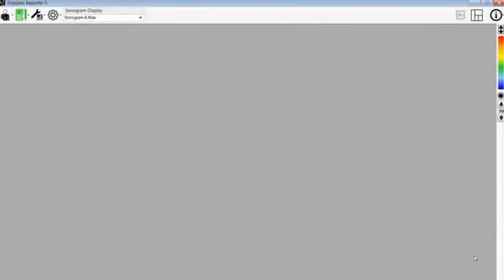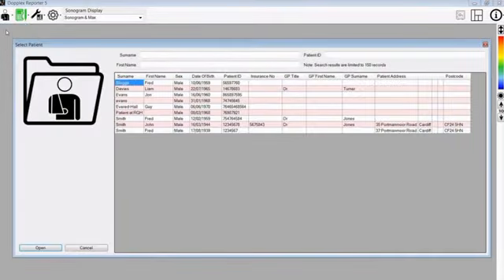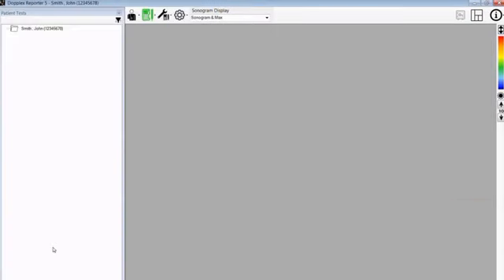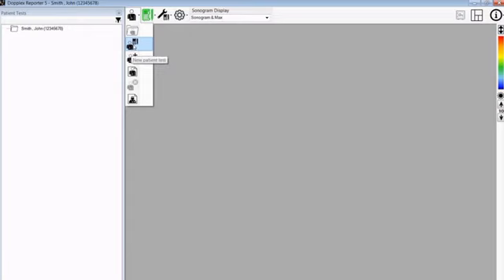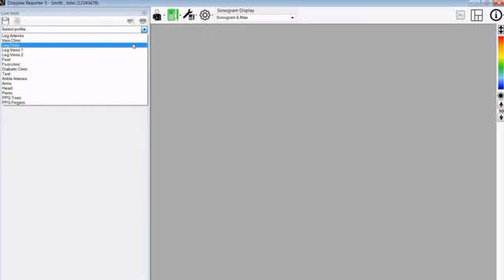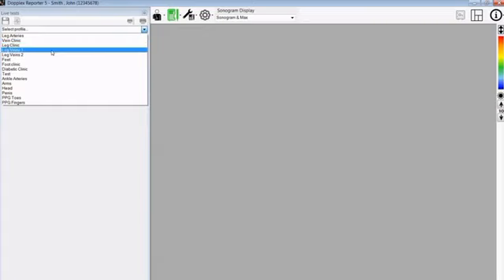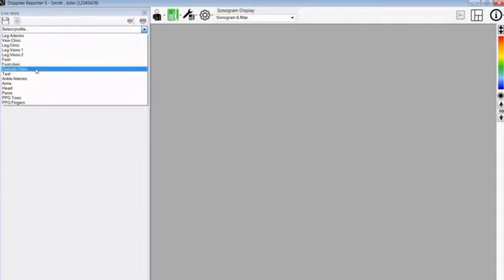We are now going to show you how to record a new patient test. Go to the patient menu and select open patient, and select the patient that we entered the patient's details for before. In this instance, it was John Smith. You can double click or press open and now you can see his details here. You can now go to patient menu and select new patient test — this is the icon with a Doppler. Then you can select the profile.